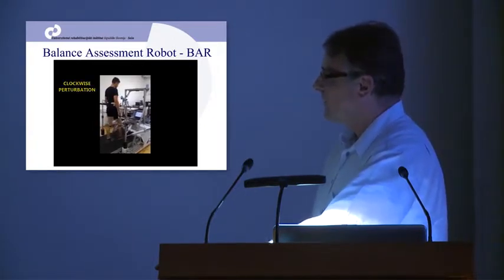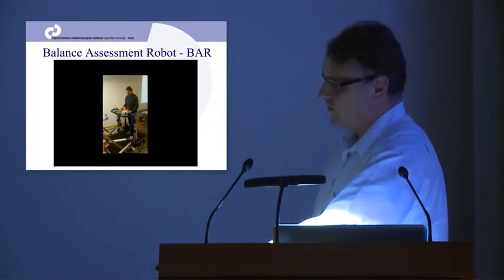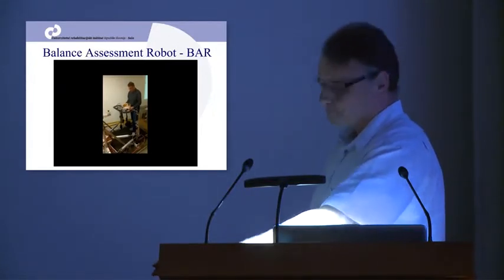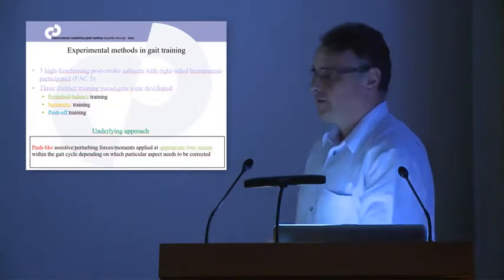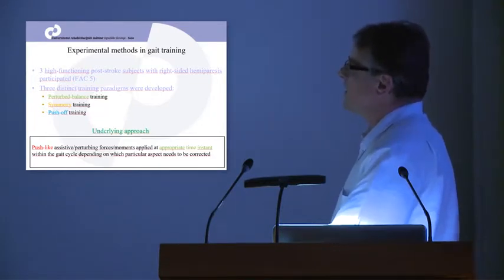That's why we built another replica of this device, which is put on the treadmill and can do similar things. And here what is also shown is the vertical actuation, the vertical haptic degrees of freedom. So now we ended up with a device which actuates 5 degrees of freedom in a haptic way, enabling different experimental paradigms, different training paradigms during walking.